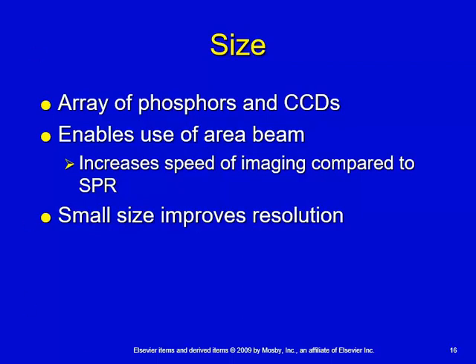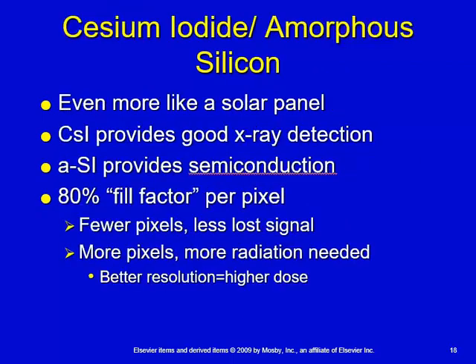So we have to have small pixel sizes and small ability to detect through our CCDs individual stimulations. So the smaller CCDs, smaller pixel sizes help to provide that.